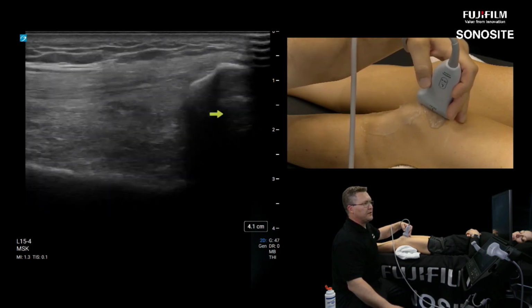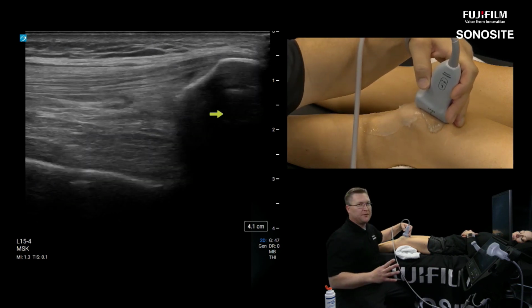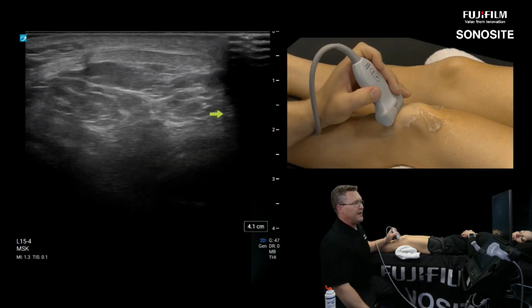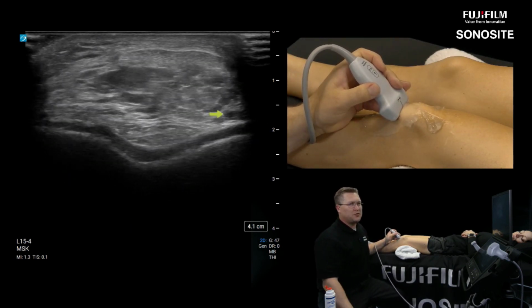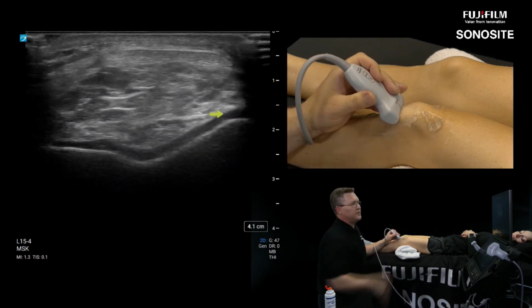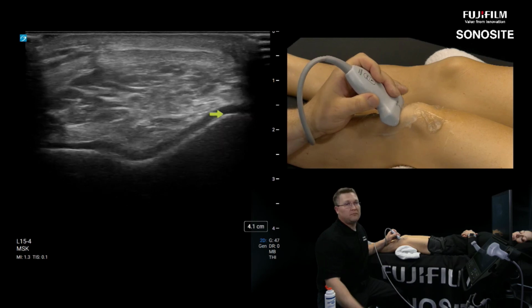So suprapatellar is the preferred approach, and I gave you 4 options to find a dry recess. So there's really no reason to come down here. I haven't seen this taught in any major workshops or courses, and I don't know of anybody personally that injects this way. I just want to give you that as a thought-provoking anatomic discussion of what we can see here.